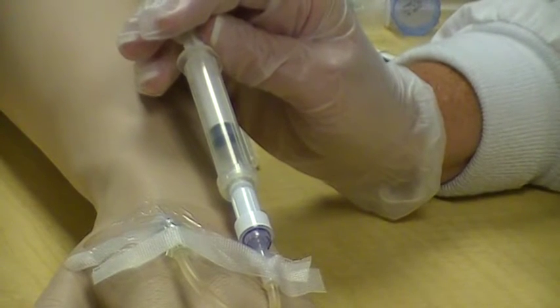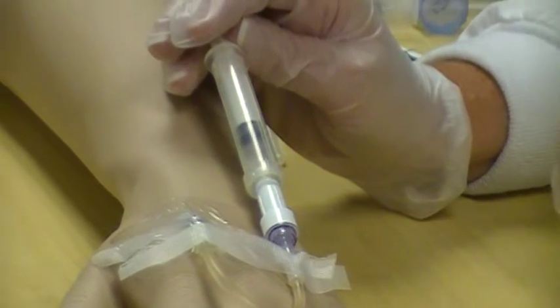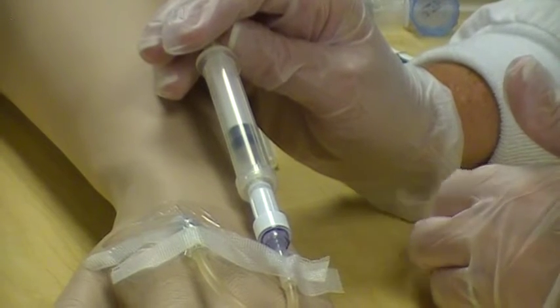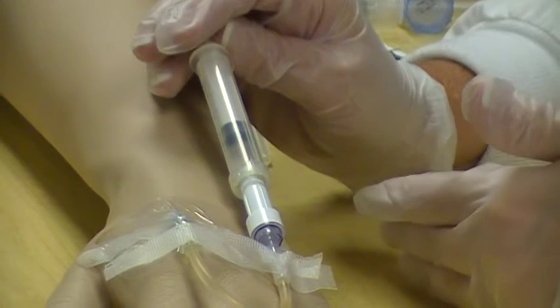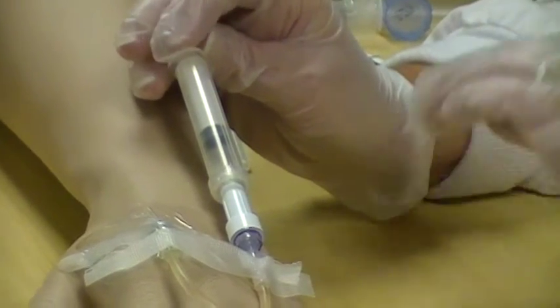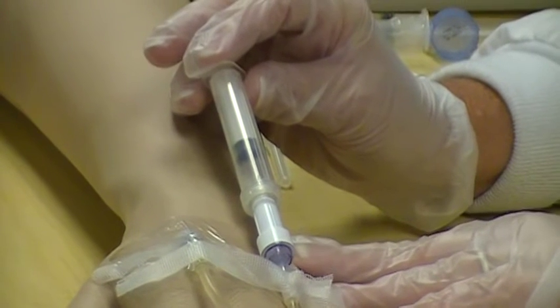Typically, when I'm administering medication over a certain time period, I hold my watch close to it. And you can either divide it up. Say if we're giving 1 milliliter over a minute, we may do 1/4 of a milliliter every 15 seconds. Or you can just kind of space it along that full minute. So again, it's up to you on what you're comfortable with.